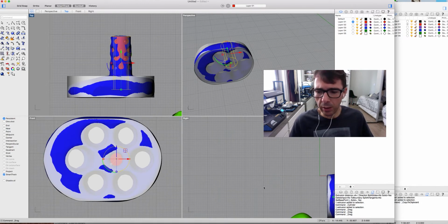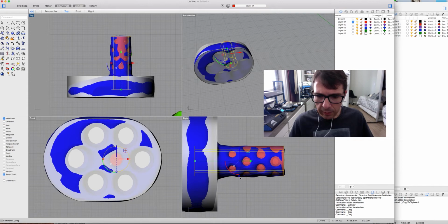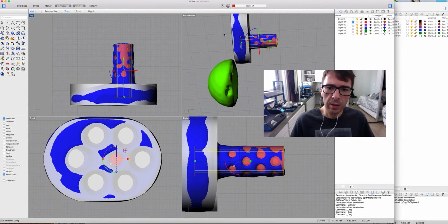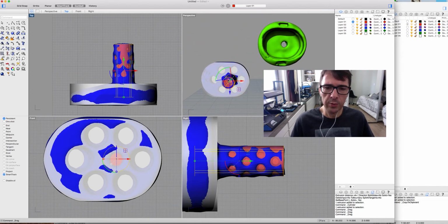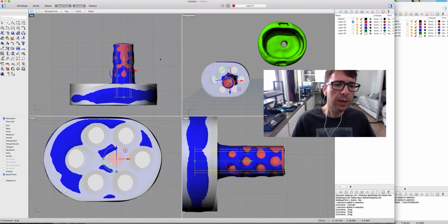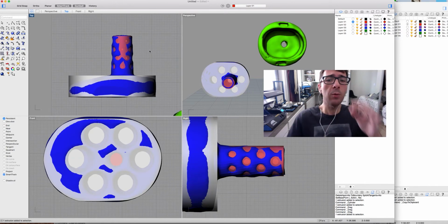And now we can look from here. We can see the correct diameter. I think we are pretty much close to what is the diameter of the peg, as we can see here. So now we have the peg, okay, and now we have the central pin. We should create a central pin guide.